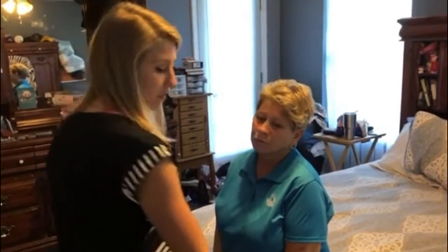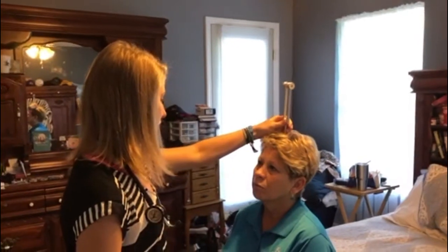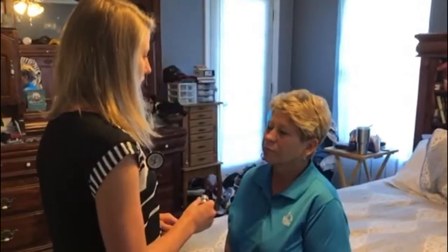We are now going to complete the Weber test. I'm going to strike this and put it in the center of your head. If you could tell me if you hear it equally in both ears. Yes. Okay, and that is a normal finding.